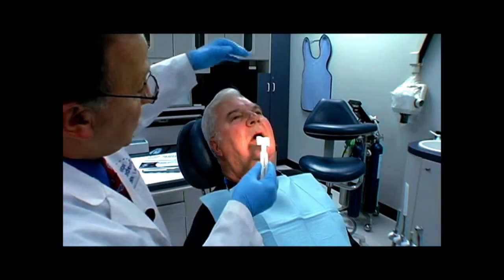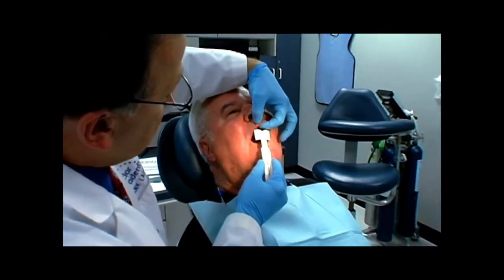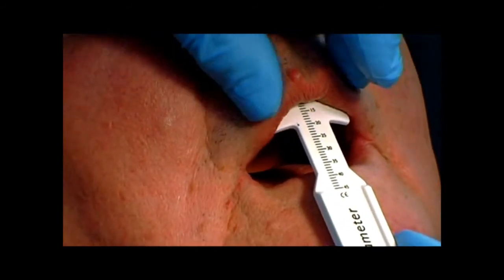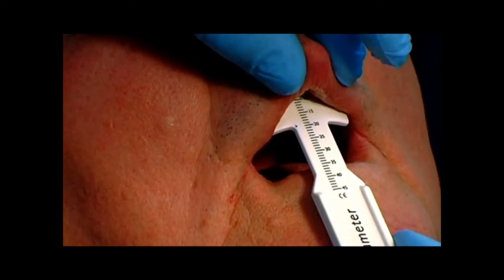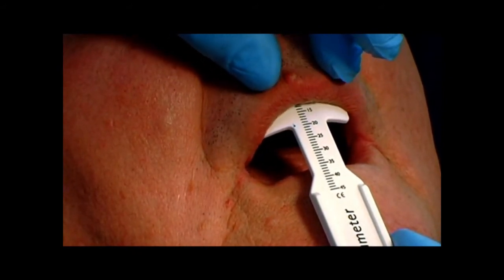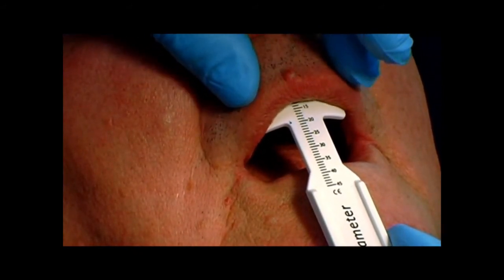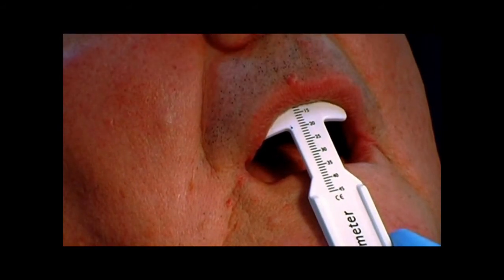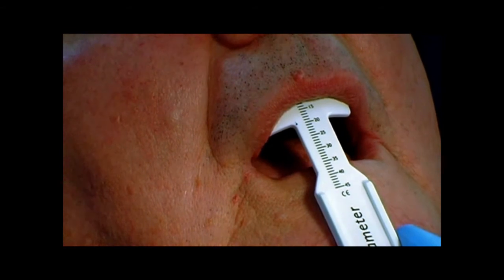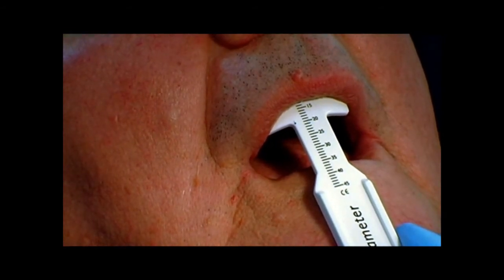Now we're going to go to the patient, and I'm going to put this gently under Mike's lip here. And again, resting this against the patient's anterior papilla, we're going to let the lip just very gently and gracefully assume its resting position. And as I look at that from my position here, I'm going to measure that at about 14 millimeters.